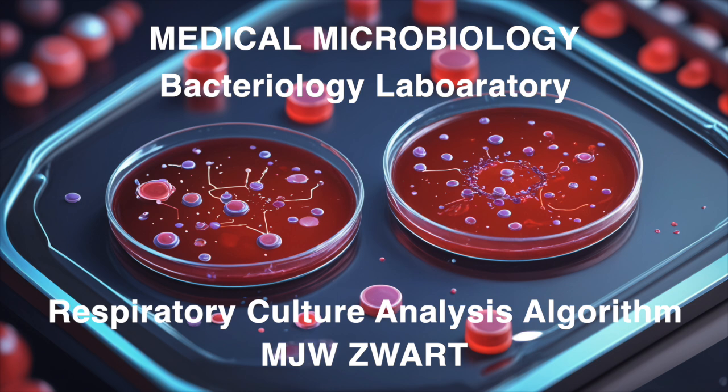Yeah. What about pathogens that are even harder to grow? Like Mycoplasma pneumoniae? That one's always a headache. Oh, tell me about it. Mycoplasma pneumoniae grows so slowly, and it can be really tricky to culture. So what do we do in those cases? Well, often we have to rely on serology or molecular methods like PCR. Sometimes culture just isn't feasible, so we have to adapt our approach.